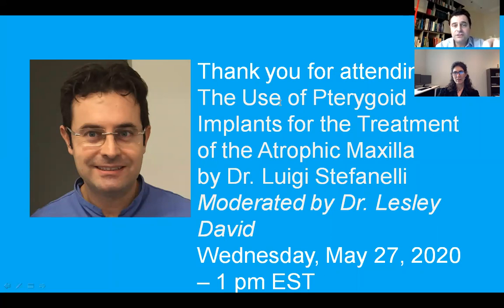You said that not a lot of clinicians use pterygoid implants, probably because the most important thing is to insert them in the correct position. In fact, if you look at the cumulative survival rates reported in the literature, there is a very interesting work by Araujo and other authors. They reported a 94% cumulative survival rate over 10 years, but the 6% of implants lost occurred in the first period, before loading. So they lost the implants for malpositioning. All the implants that were loaded stayed there without any problems over 10 years.